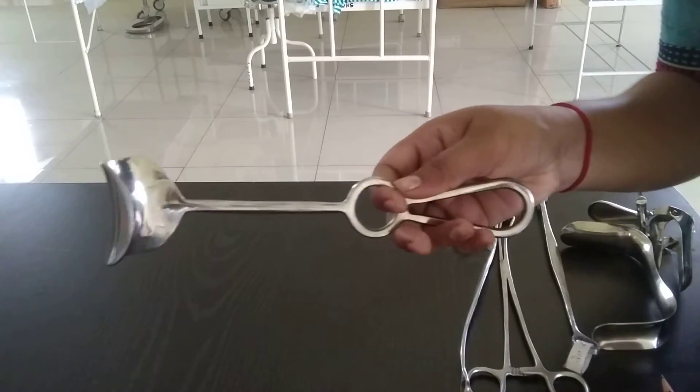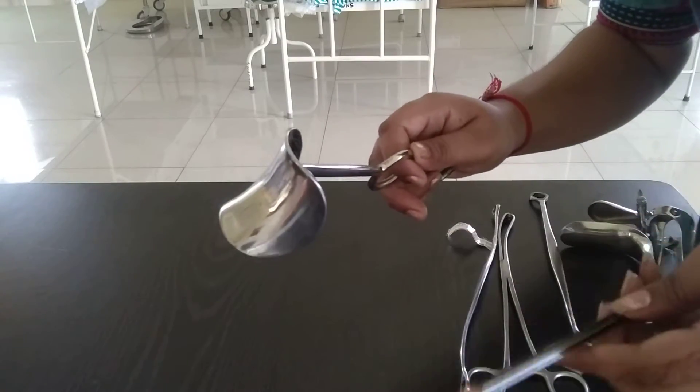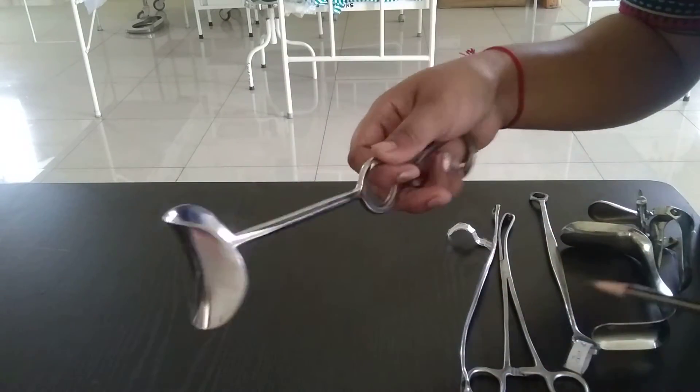This is Duane's retractor. This is the blade of Duane's retractor.